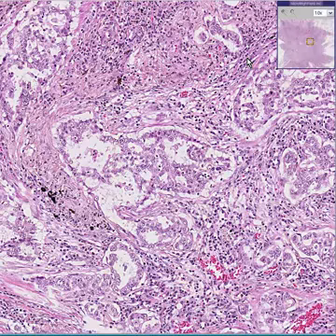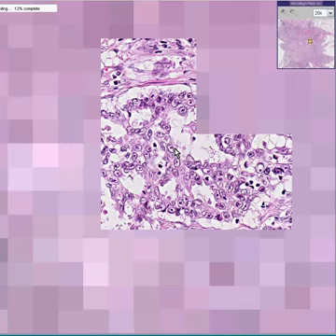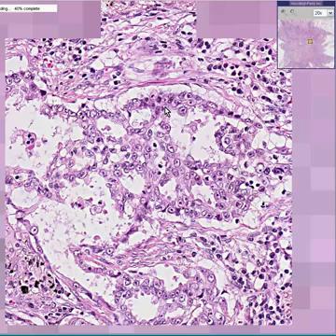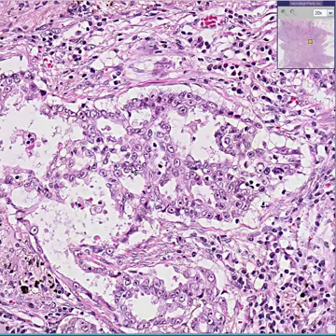But a solitary peripheral adenocarcinoma would more likely be a primary than little tumor nests all over the place. In this case, it was a primary, but you'll have to take that on faith, because if you said, could this be a metastatic colon cancer or pancreas cancer, I'd have to say yes, yes, yes. And once again, all the cytologic features of malignancy as well. Big nucleoli, lumpy, bumpy nuclei. There's a mitosis, there's a mitosis, there's a mitosis.